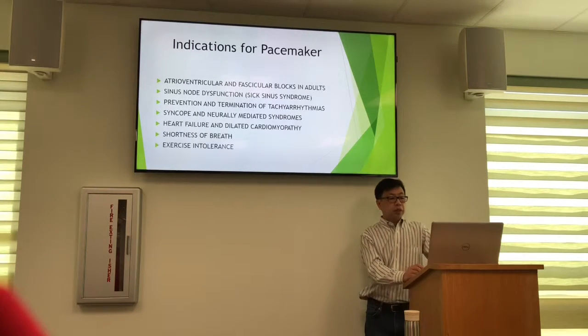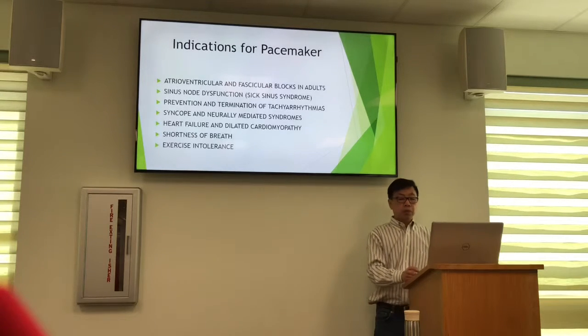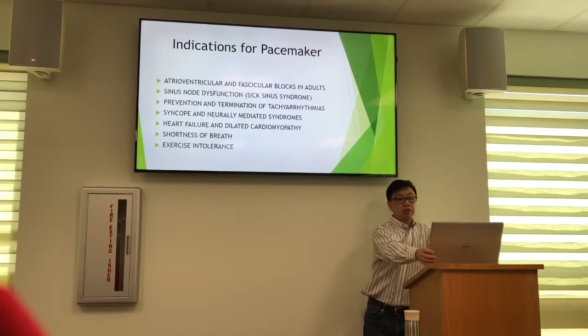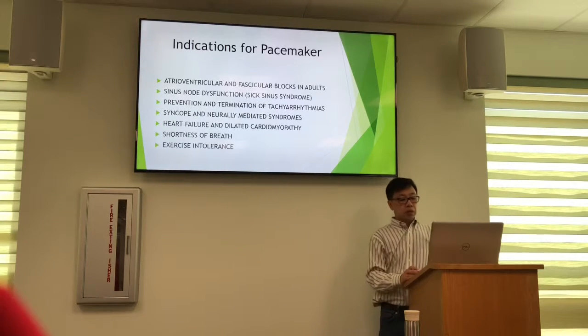Permanent pacemakers are implanted in adults primarily for treatment of indications such as sick sinus syndrome, acquired AV blocks, and other conduction blocks. It is also effective in prevention and treatment of tachycardia and in the form of neurocardiogenic syncope. Biventricular pacing has recently been shown to be an effective treatment in advanced heart failure patients with major intraventricular conduction defects, predominantly left bundle branch block.